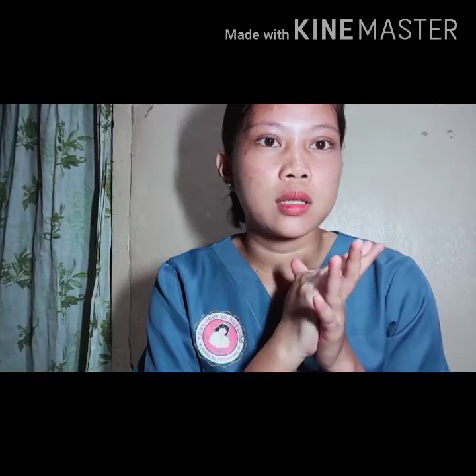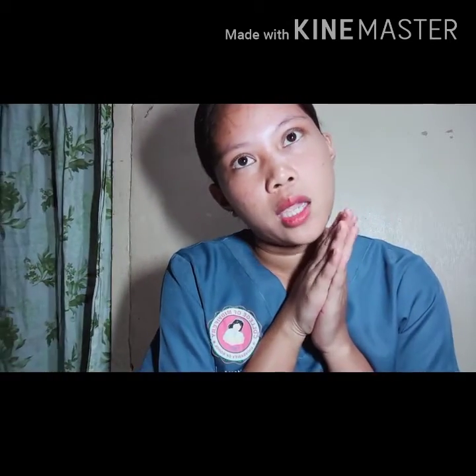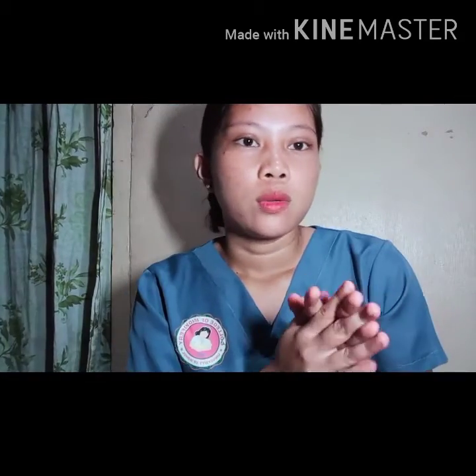So next is document the relevant data including assessment. So everything nga you've done into your patients, so you must document any data including assessments. So after ka nag-record na mo nakaukuan, the last thing na imuhang buhaton when you do an intravenous therapy is mag-record ka sa data, but the most last thing is you wash hands. So pinaunahan is wash hand ka, so after dapat mag-wash hands na pud ka. So to observe proper hygiene and to reduce contamination. So that would be the steps or procedures on how to start an intravenous therapy.